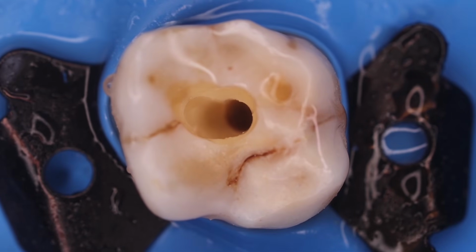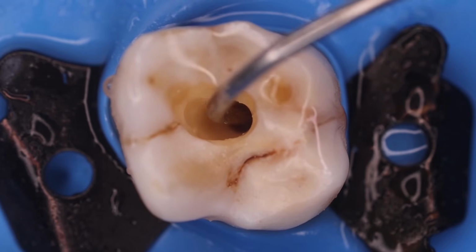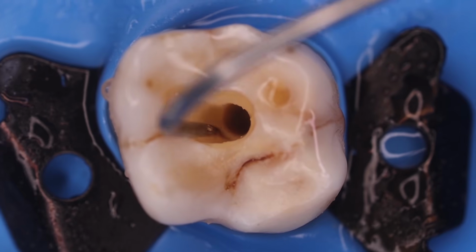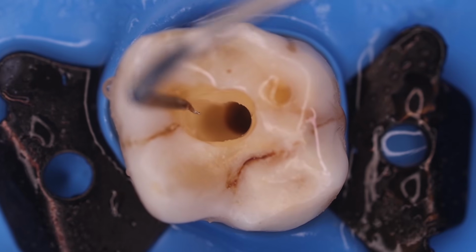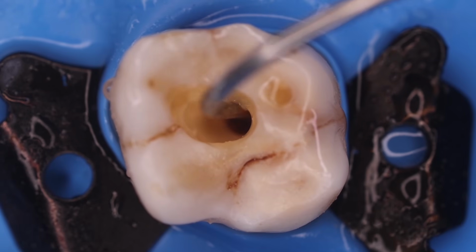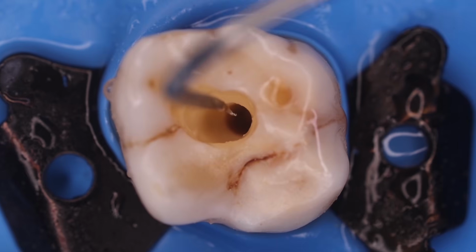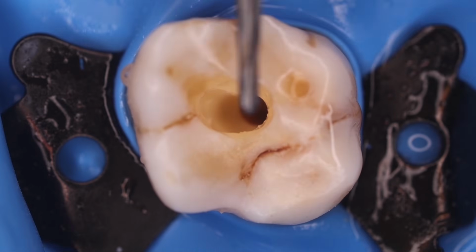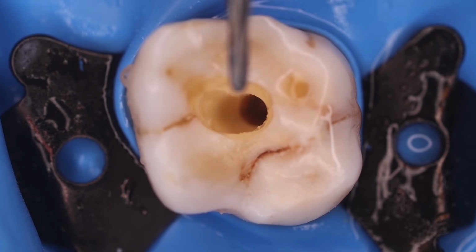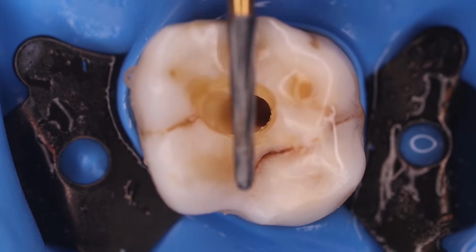Now you can appreciate that we have achieved the burr drop with the help of the round burr, and we are into the pulp chamber. Now we can change our burr to the Endo-Z burr to form the access cavity shape outline, as we are safe for the pulpal floor and able to locate the canal orifices. So this is the Endo-Z burr that we are going to proceed with now to prepare the access cavity shape on a safer note.